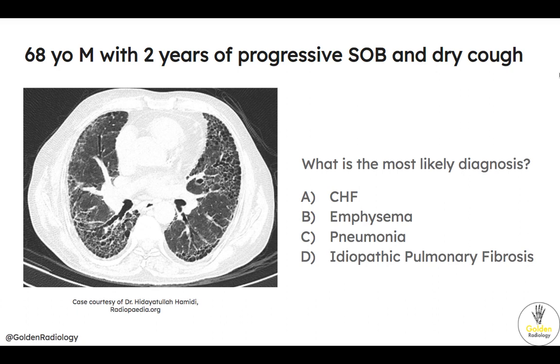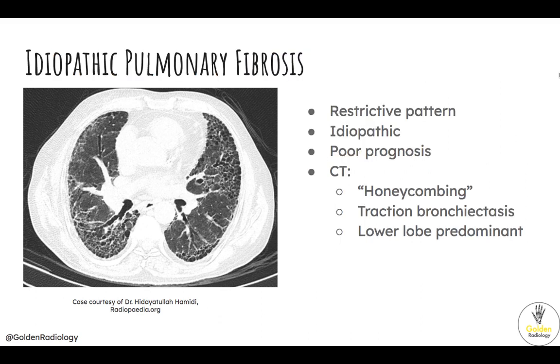Next question: 68-year-old male, 2 years of progressive shortness of breath and dry cough. What is the most likely diagnosis? This is idiopathic pulmonary fibrosis. The CT sign here is the classic honeycombing appearance, which most commonly occurs in the lower lobes in the periphery of the lungs, right abutting the pleura. You can also get traction bronchiectasis, where the bronchioles are dilated, caused by scarring and fibrosis of the destroyed lung parenchyma tugging on the bronchioles. Idiopathic pulmonary fibrosis will have a restrictive pattern on PFTs and is associated with a poor prognosis.